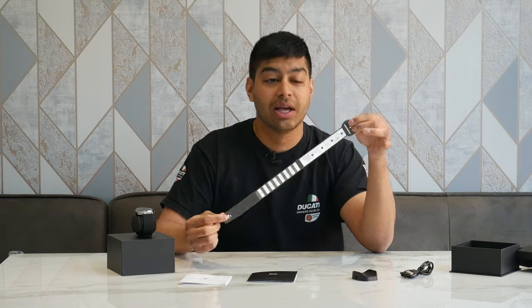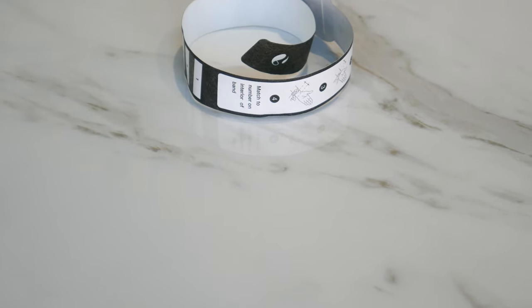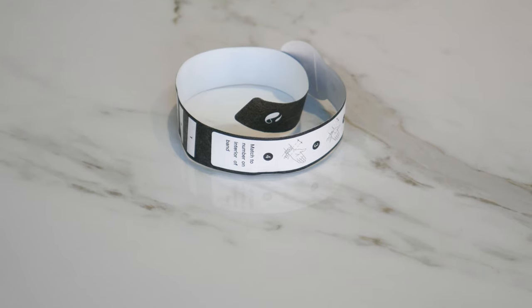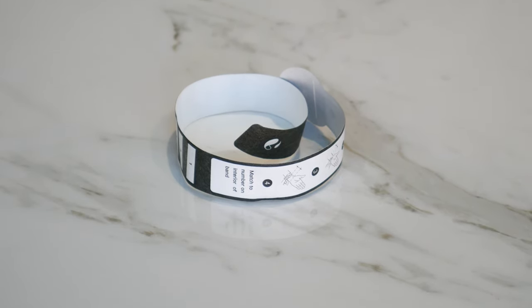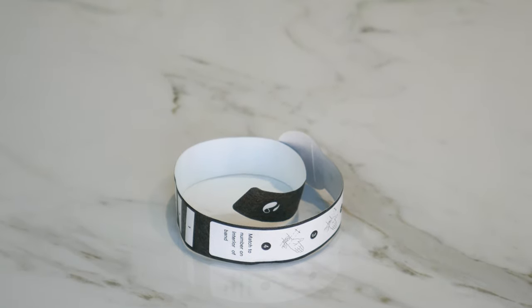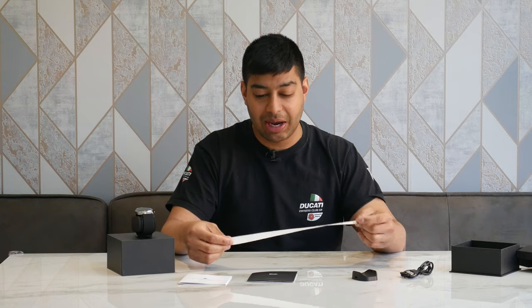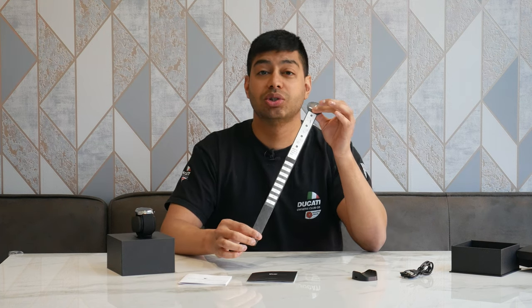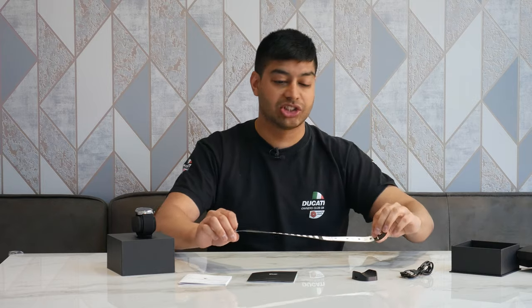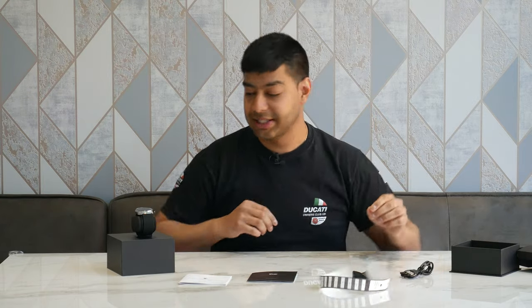You also get a measuring tape guide to put around your wrist to give you the optimal tightness for the blood pressure monitor wrist strap to activate properly. It tells you how to use the measuring tape to get the wrist strap at the right setting for your wrist.